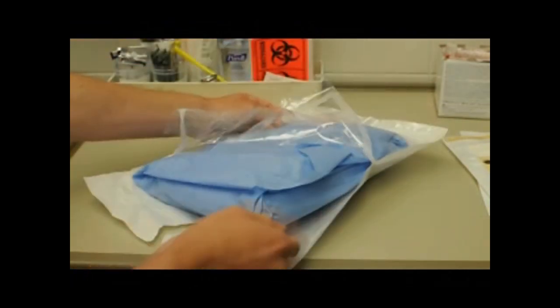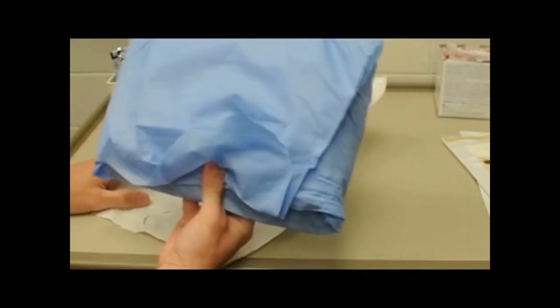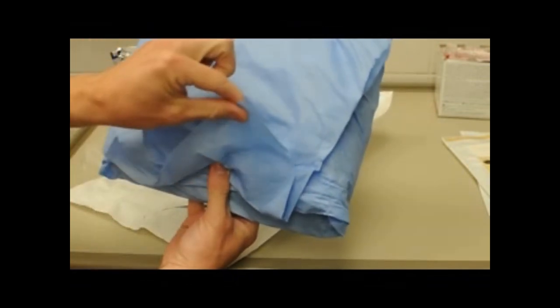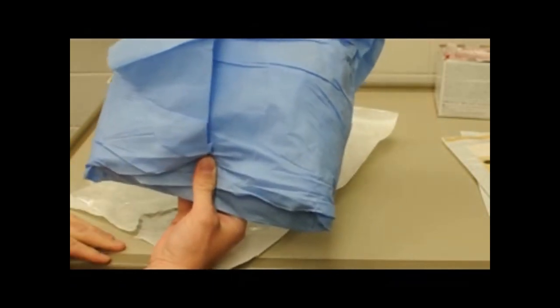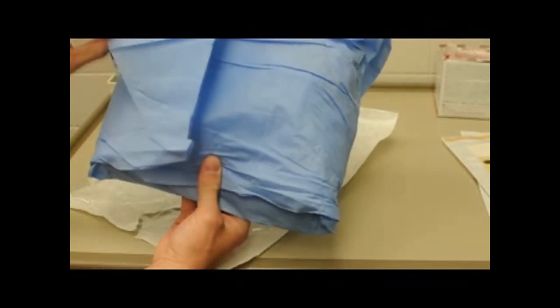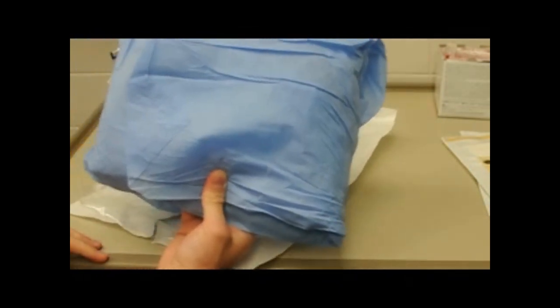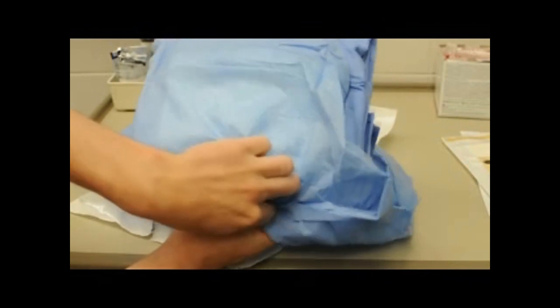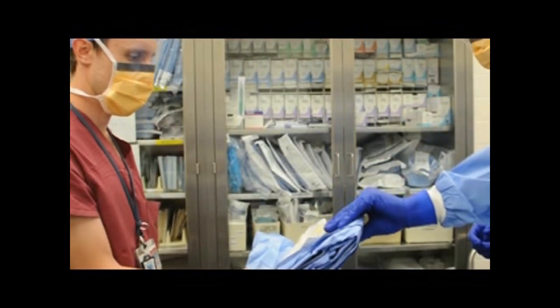First, open the package your gown is in and take it out. You can touch the blue outside wrapping of the gown. Hold it with one hand so the triangular flap is facing due south, and with the other hand, pinch the flap and lift it up and behind the gown, grasping it with the holding hand. Take the next visible flap and bring it to the left and behind, both covering and gripping with your holding hand. Do the same thing for the last flap. The goal is to expose the sterile gown underneath while covering your holding hand with the gown cover, which lets the scrub tech grab the gown in a sterile way.